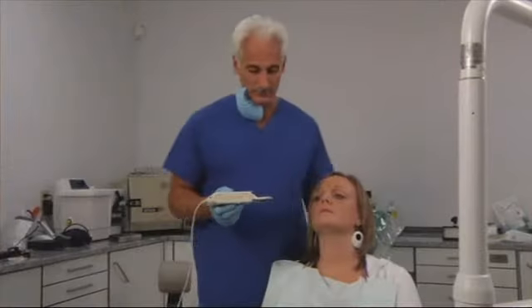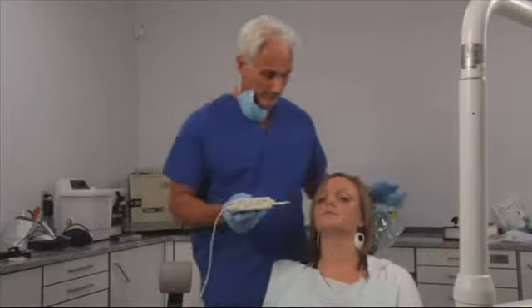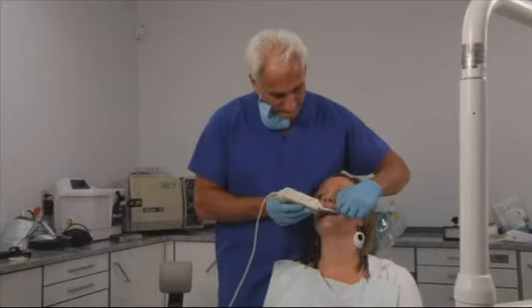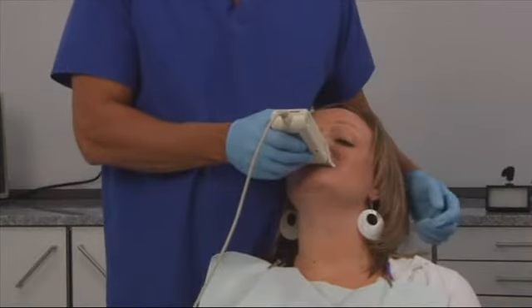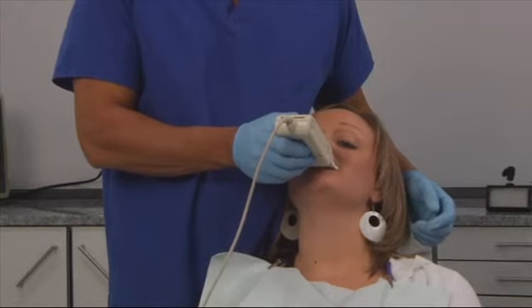Okay, Carolyn, we're going to re-record now, going right, left, and forward. Okay, put your head back. This will be to the right. Go ahead and bite down again. There we go. Open, bite down again. Now go to the right. Good. Excellent.